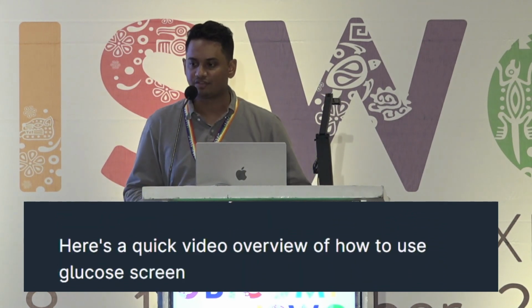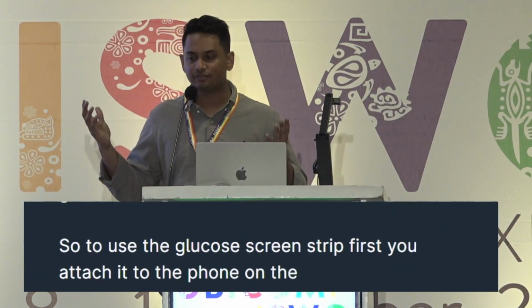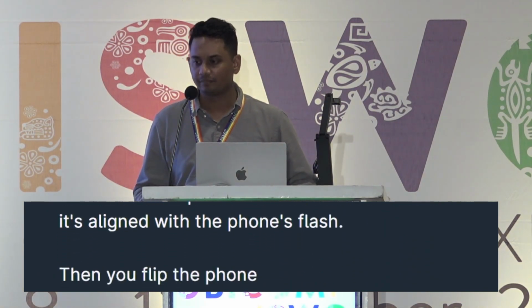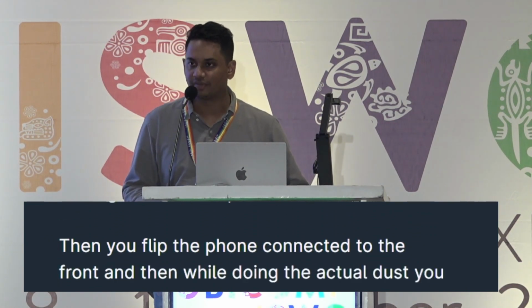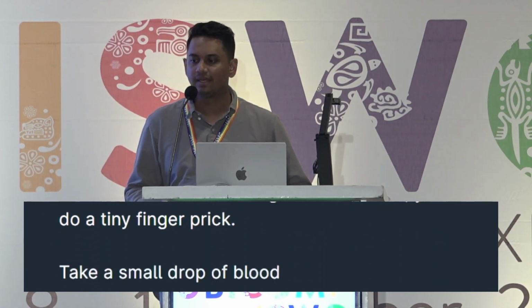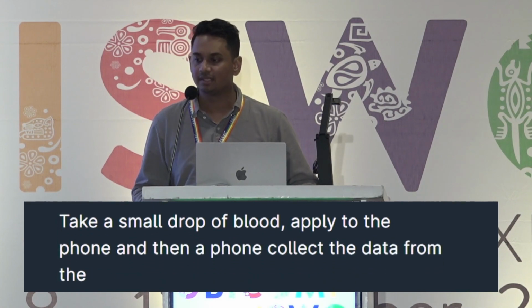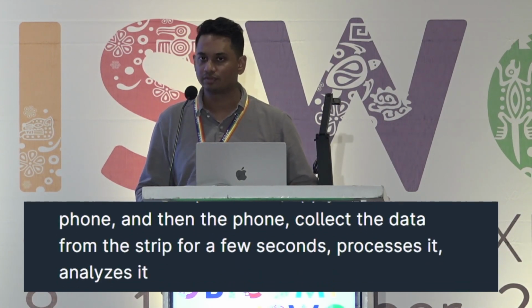To use the GlucoScreen strip, first you attach it to the phone on the back side so that it's aligned with the phone's flash. Then you flip the phone, connect it to the front, and then while doing the actual test, you do a tiny finger prick, take a small drop of blood, and apply it to the strip. The phone collects the data from the strip for a few seconds, processes it, analyzes it, and then shows you your blood glucose level.